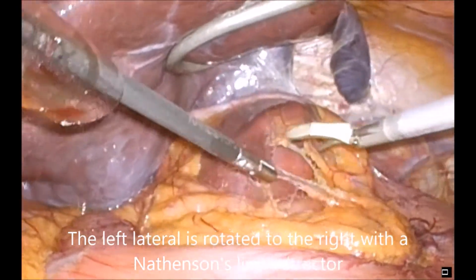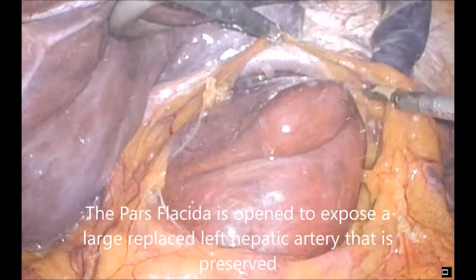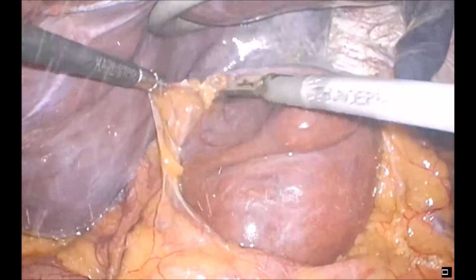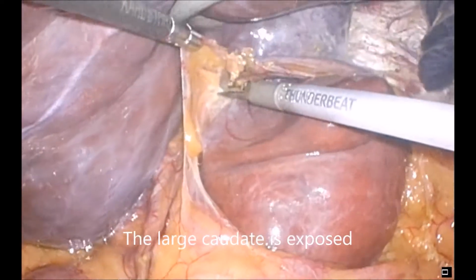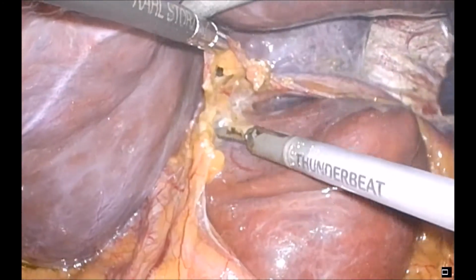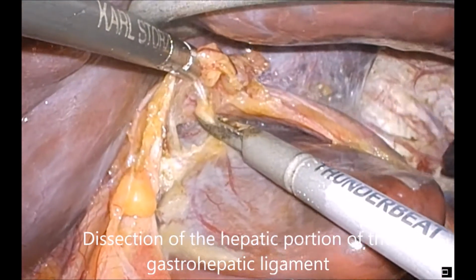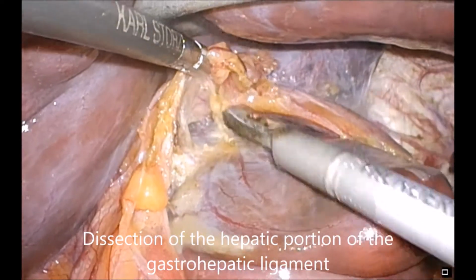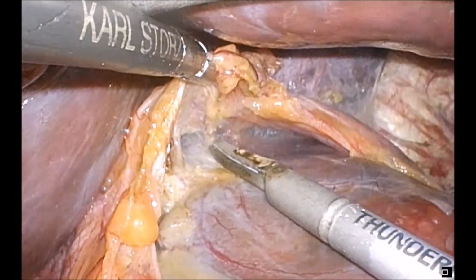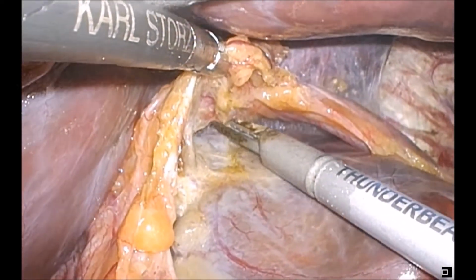We can see here the veil of tissue overlying the enlarged caudate lobe, and the replaced left hepatic artery is seen flopping over the top. Of course, it is possible to ligate and divide the aberrant left hepatic artery, but given the abnormal anatomy here, it was decided to leave the hepatic artery in situ. This was then just an extra problem to have to deal with.